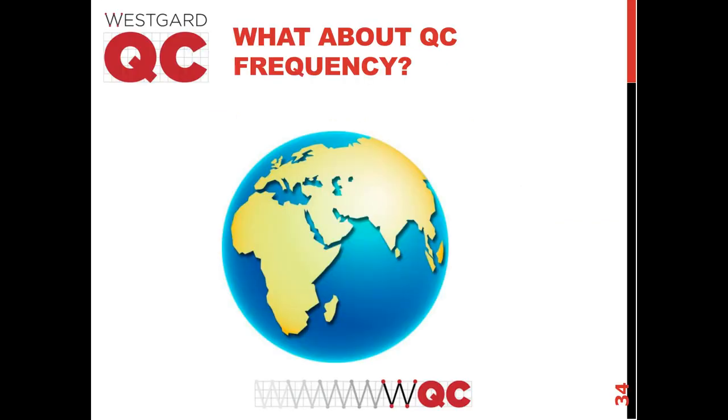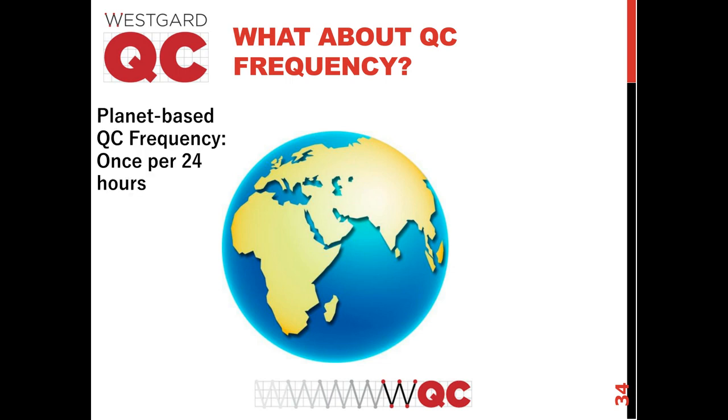And now let's talk about this QC frequency. I've sort of flirted with it, but I haven't told you any details. QC frequency pretty much is governed by what I would call a planet-based QC frequency. That is, we run it once every revolution of the planet. The planet rotates every 24 hours, thus we run our QC every 24 hours. Is there a relationship to the good of the process to the rotational speed of our planet? Not really. This is just a compliance. We're just meeting regulations.